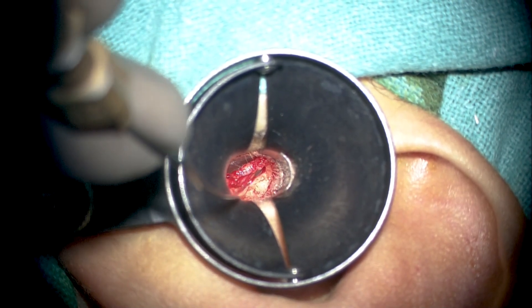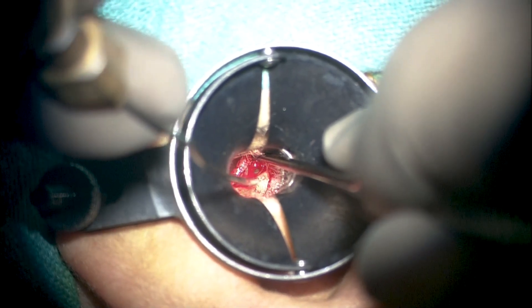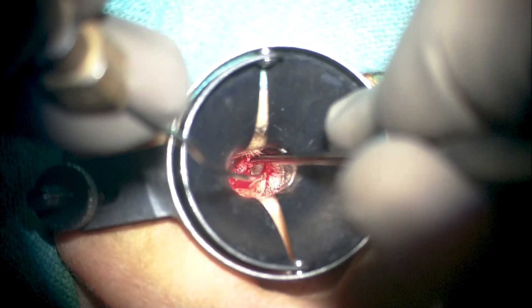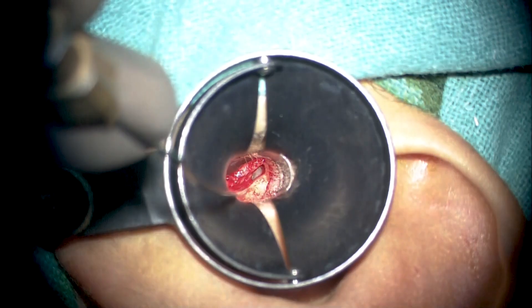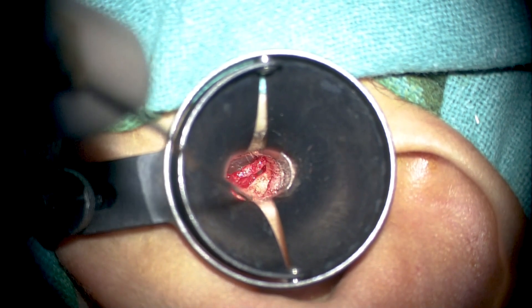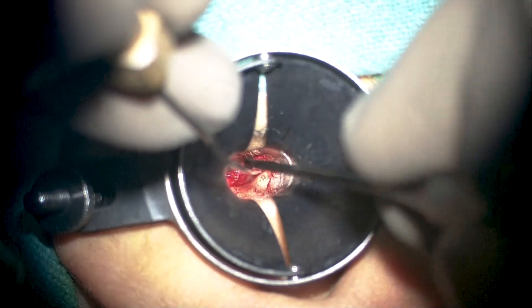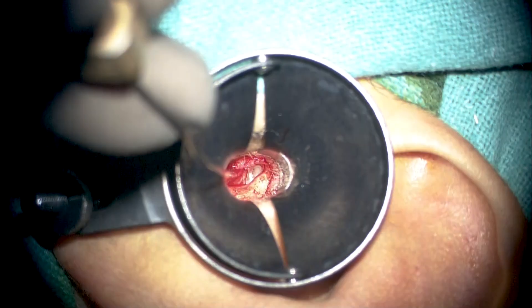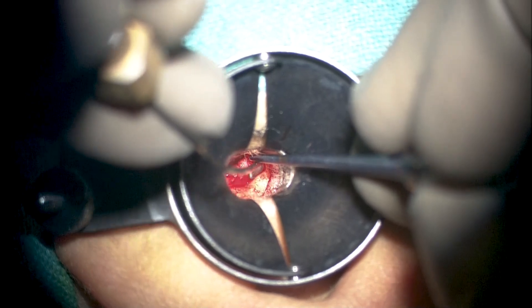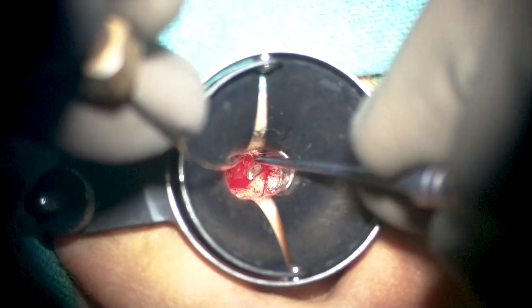It is very important to use a thin and appropriate suction with your flap knives or circular knives as we enter the middle ear, because a larger-than-usual suction or high suction pressures are the worst enemy during middle ear flap elevation. They often lead to tears or rents in the canal skin or the tympanic membrane — most certainly in the weak posterior superior drum. Using a thin suction kept at low pressure allows direct contact with the frail canal skin. Using cotton balls should also be avoided due to the risk of leaving cotton fibres in the middle ear, which could lead to granuloma formation.